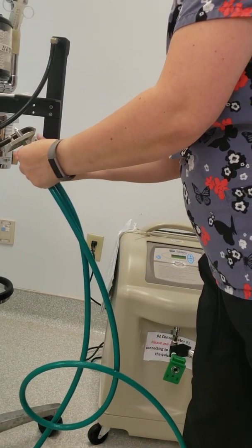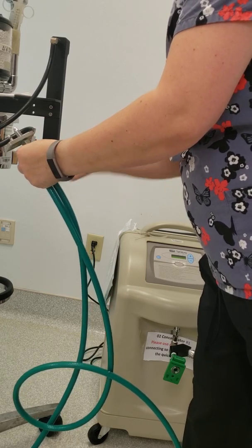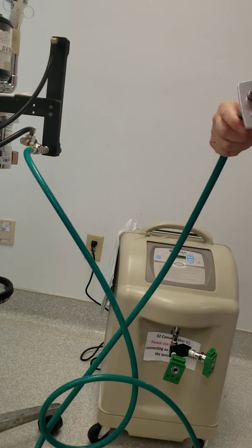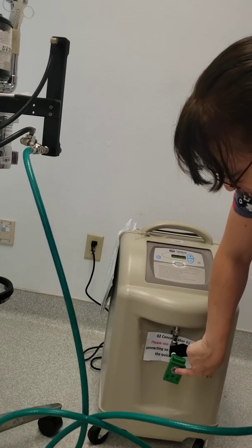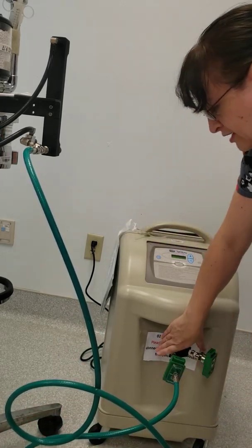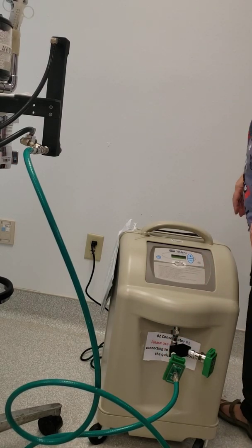You want to hand tighten it and it just threads on. The quick release has a big peg and a small peg — on here you're going to have a big hole and a small hole. You just connect those together, and support this as you're plugging into it as it is very flexible.